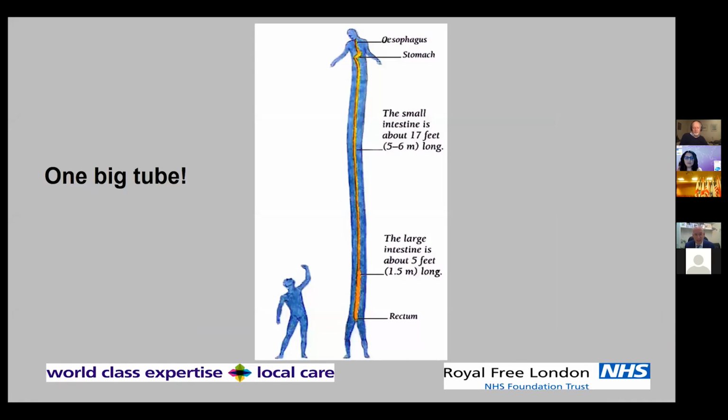In essence, I'm just a plumber, and it's quite easy actually. The tube's fairly straight and long, and you can go from either the top end or the bottom end. My wife would certainly argue with the thought of me being a plumber, because I'm totally useless at home when it comes to fixing anything. But certainly with an endoscope, I can find my way around. Either the bottom end or the top end seem to be okay.